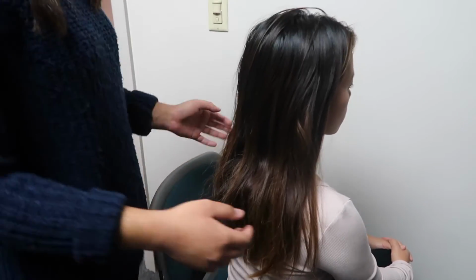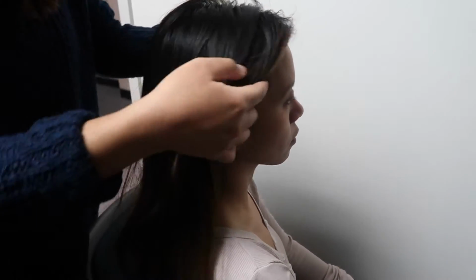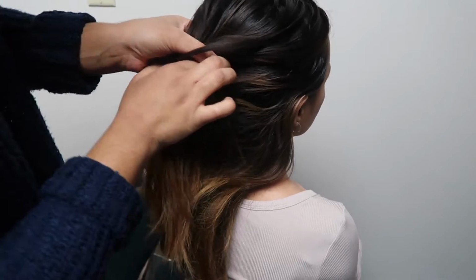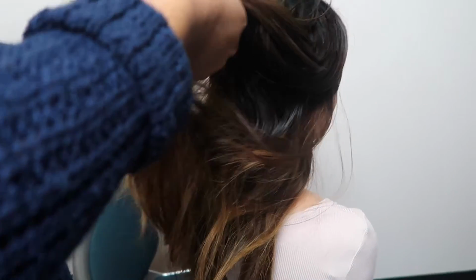Okay, so first you want to start with the hair down, and then look in line with the eyebrows of who you're collecting it from. So trace a line from each eyebrow, and then just create a straight line towards the back of the scalp. And then you're going to separate the hair into two large sections, a top and a bottom.